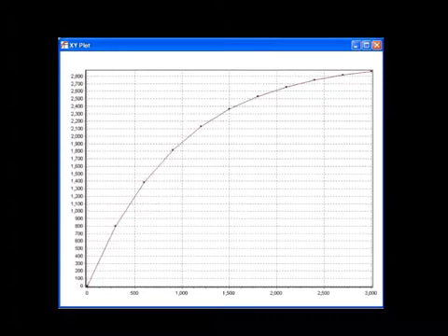I was just wondering what the definition of a buildup constant would be. Is that just like 50% of the maximum? Oh, no. It's basically the time it takes to reach 1 minus 1 over e of the maximum, which is approximately 63% of your maximum polarization.